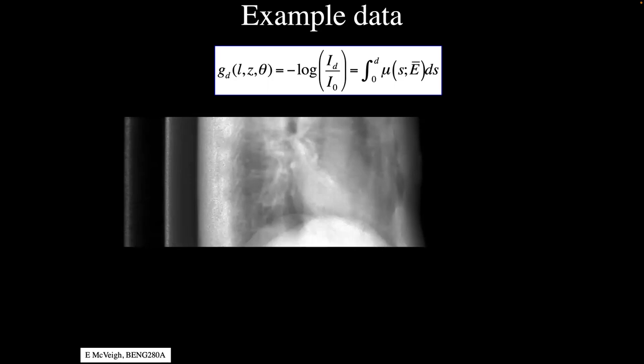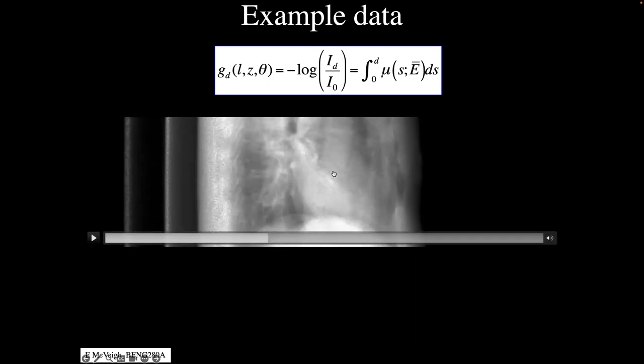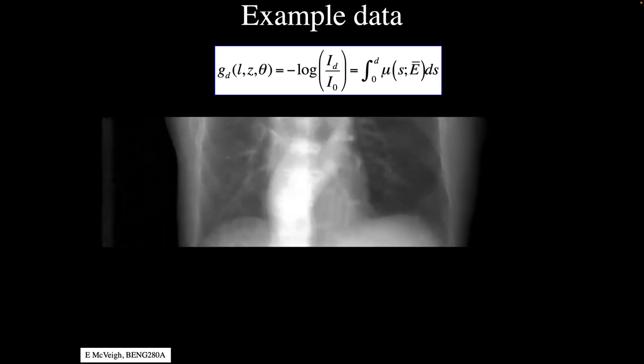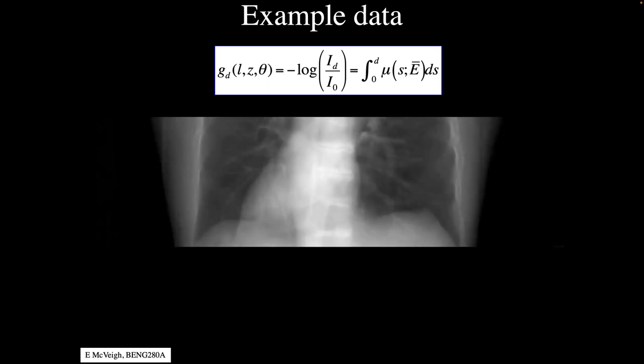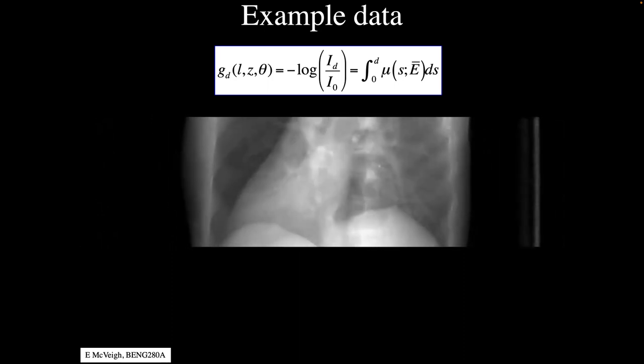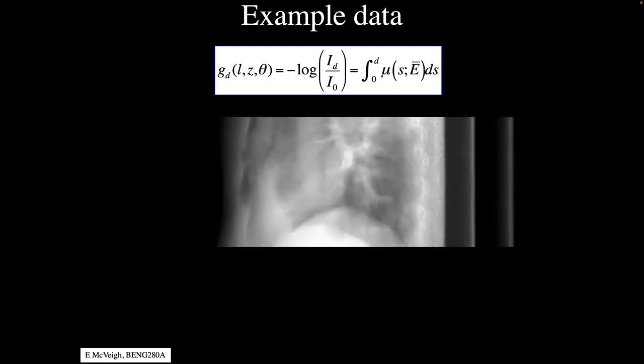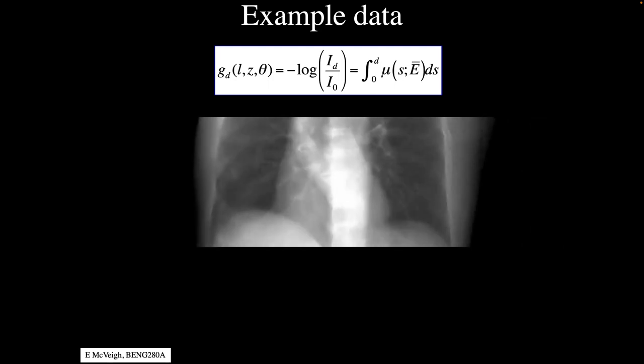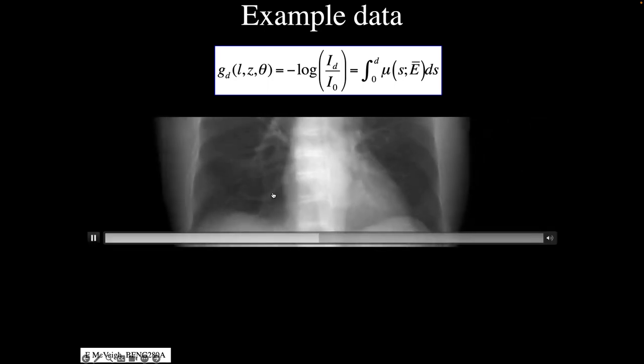So it's basically the patient is thick enough there and our x-ray tube is on to a certain level of intensity such that we run out of photons at the detector. And so it starts to get a bit noisy, right? Not a bit noisy, a lot noisy. Okay. So you do want to try and manage the amount of photons that you dial up while you're making an image such that you get photons on your detector, right? And so it depends on the size of the patient. If you have a big patient, you're going to crank it up, put more photons through just so you get some out, okay?